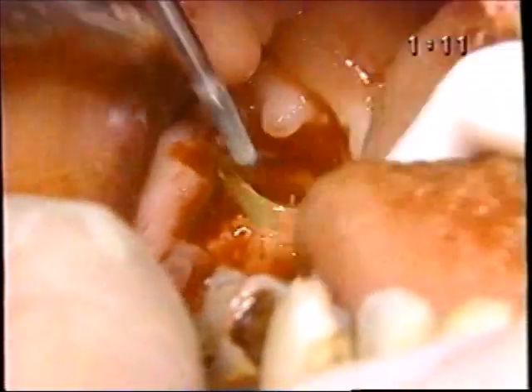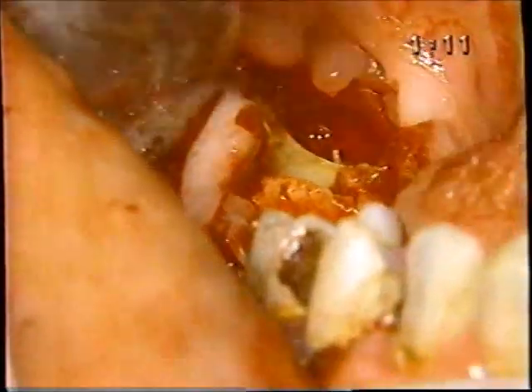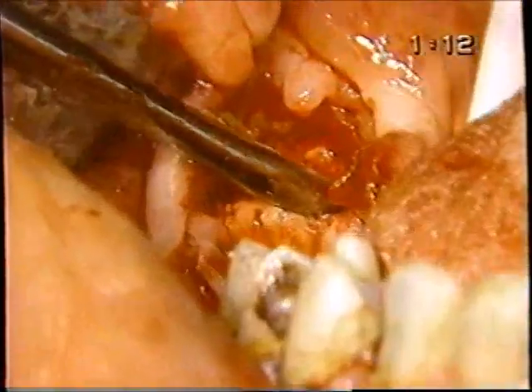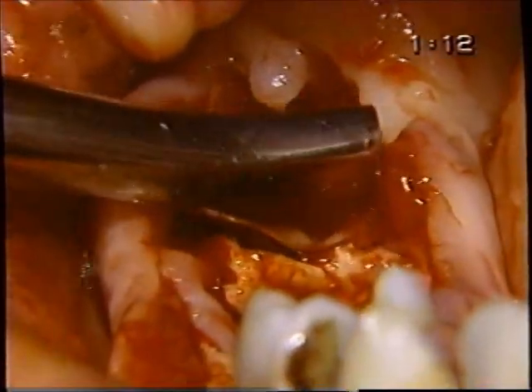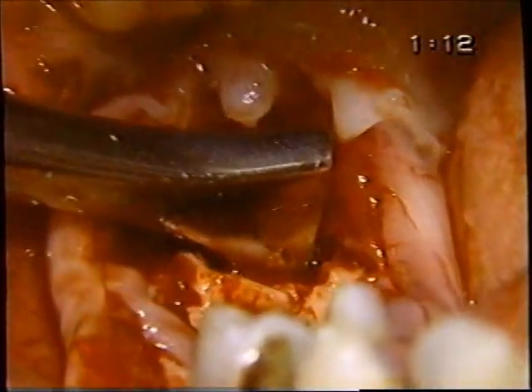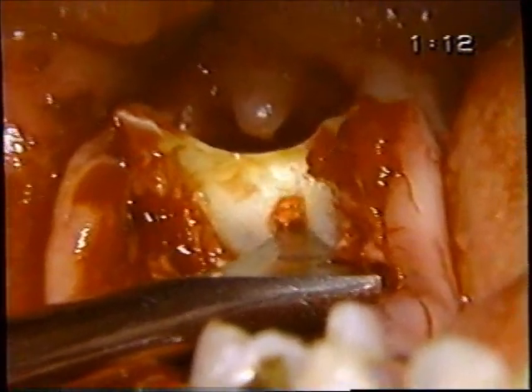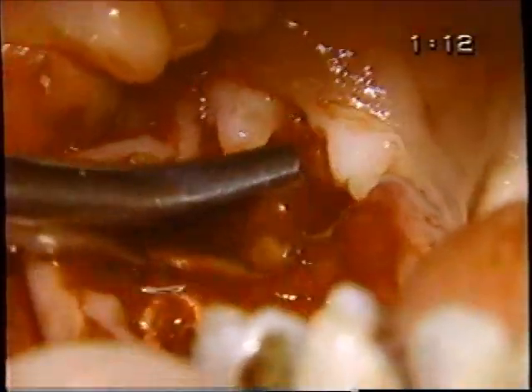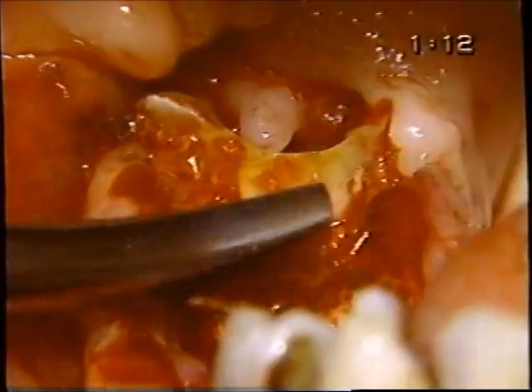Wash it off, if you would, a little bit more. First, let's use the 301, then the 34, and then the crier. Okay, we're going to use the crier. Sometimes we need to make a purchase, but we didn't need to this time, with the burr. It looks like using that interseptal bone as a fulcrum. It's loose as a goose, and there it is.